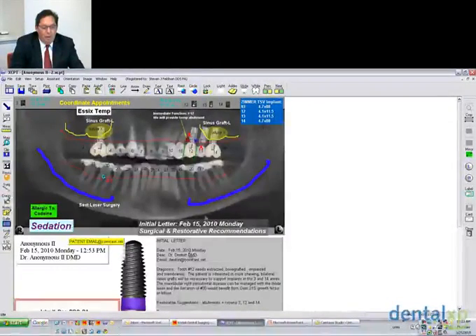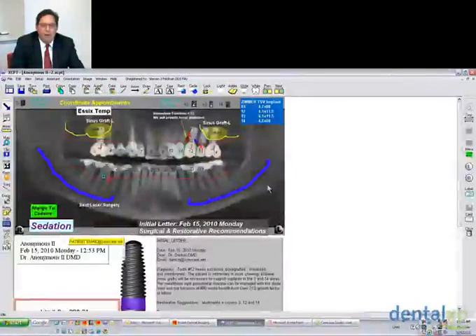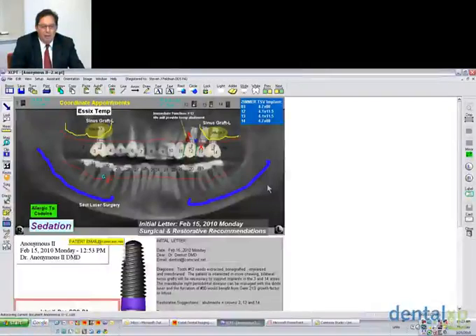And I went into the CT, and right now the CT we purchased, we placed in the office, was the Kodak 9500. The reason I purchased that was because I wanted to find something that I could evolve care with, not just in implants, because I felt that implants were reasonably simple in terms of, is there enough bone, is it deep enough, wide enough, thick enough, and so on and so forth, to place implants, or do I need to do some advanced bone grafting?